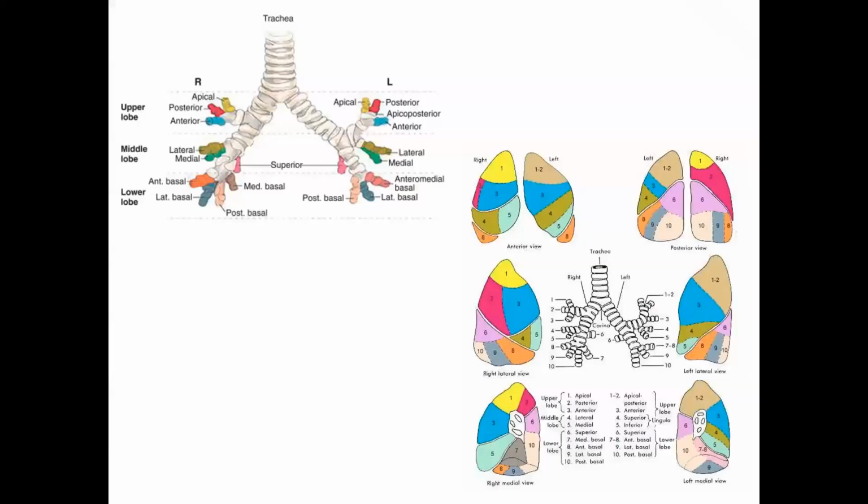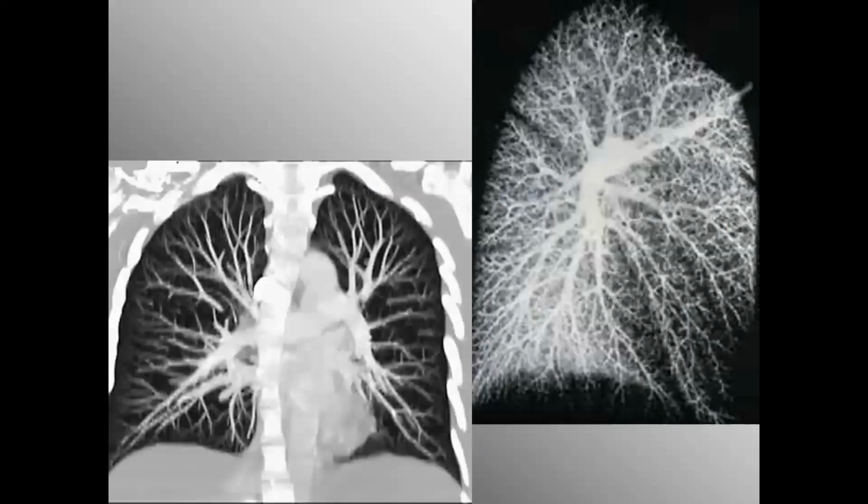We've all seen these schematics many times, I'm sure, but be reminded that yes, we have two lungs, each with lobes, but many segments. It's just a good reference as you consider what specific portions of lung tissue might be affected by disease and how that might affect a patient's chest X-ray. And we're going to get into some good practice here in a few moments, but still making sure we're together, laying some groundwork. And don't worry, we're going to jump in for you super clinicians out there and give you some challenges coming up.